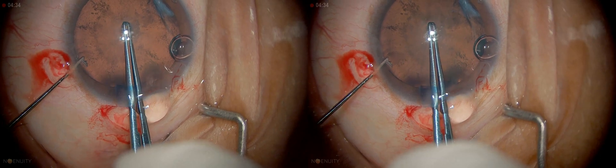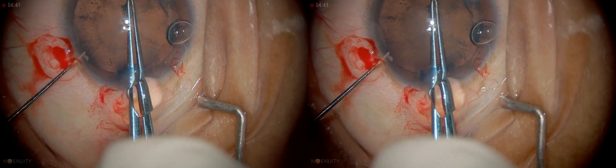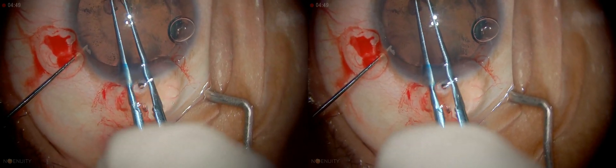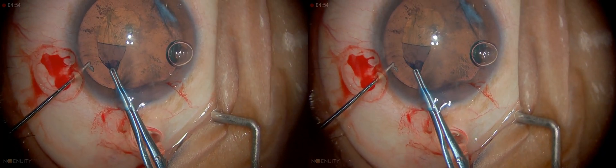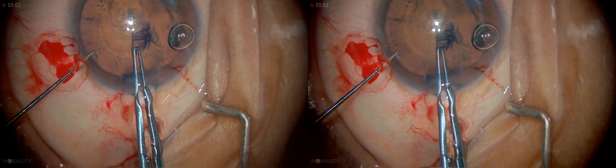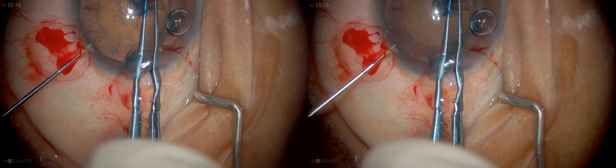I'm going to lift up a small flap, then I'm going to start tearing. It is always easy to follow the margin of the pupil when doing the rhexis — in that way it becomes easier to size it and to get a central rhexis. So it is very controlled, slow. Grasp and re-grasp.